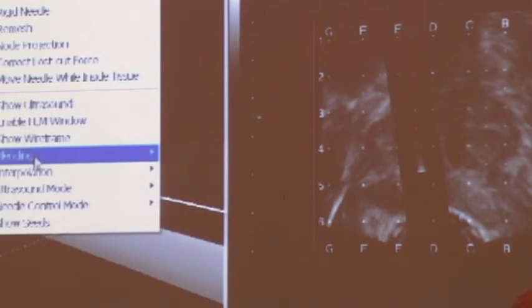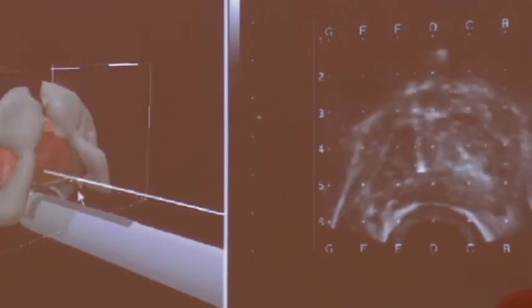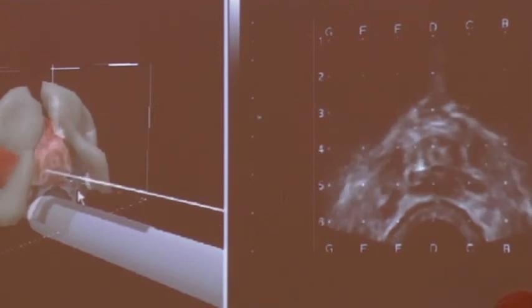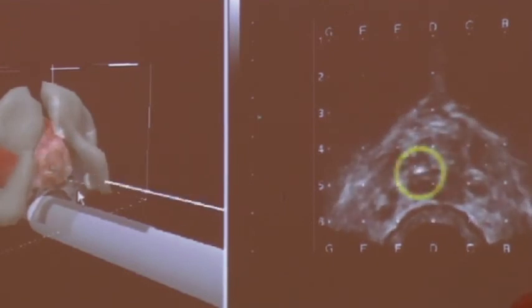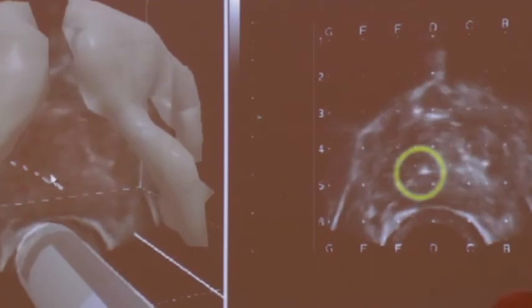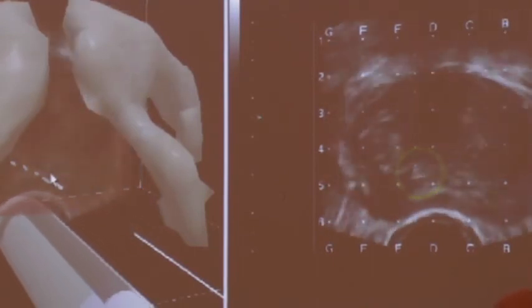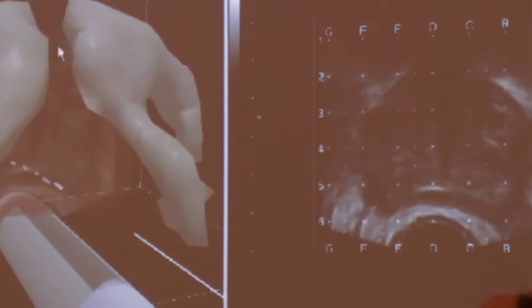Can I check? And yes, based on the simulation and the volume study, you can practice on a specific patient with the specific image and physical properties, or very close. That's the big picture of where I hope this is going: both general training and per-procedure training.